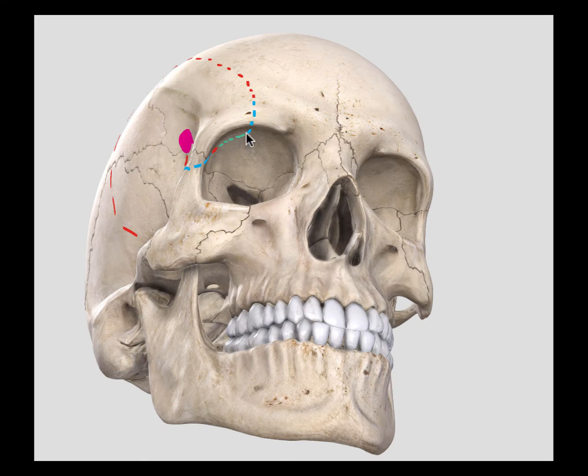The extent of the superior orbital wall that was removed with this craniotomy is limited. After the craniotomy is done, if you want to remove more of the orbital roof, you can rongeur it or up-cut it.